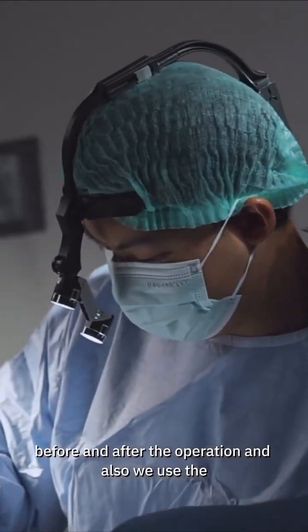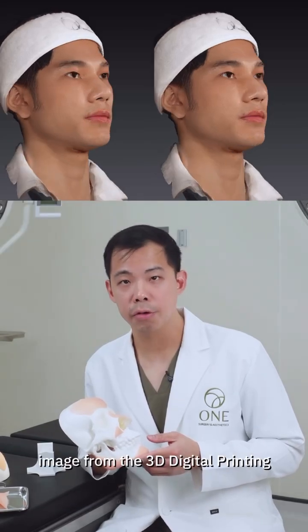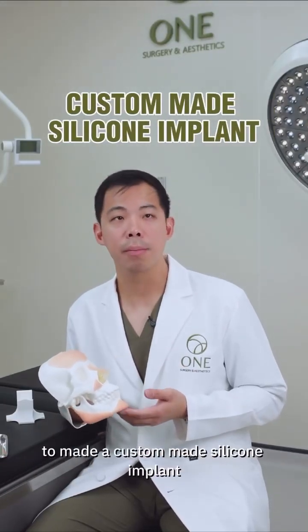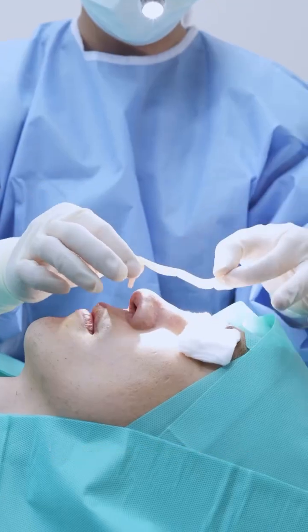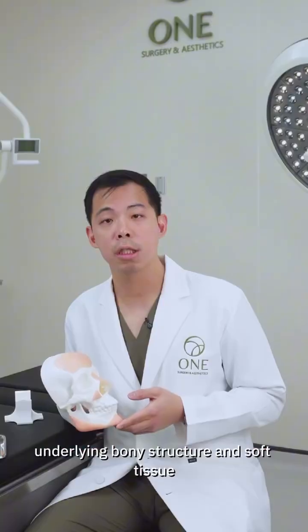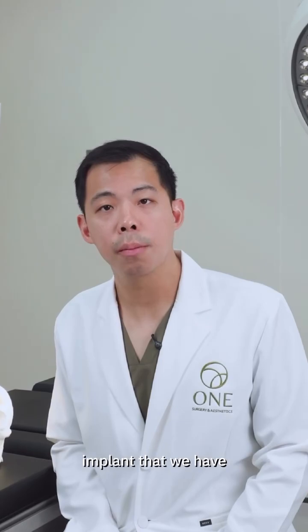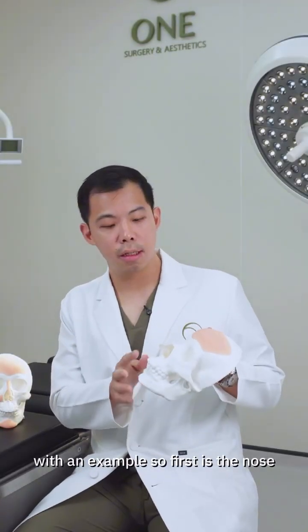And also we use the CT scan or the CAT scan together with the image from the 3D digital printing to make a custom-made silicone implant. Here as you can see, these custom-made silicone implants will have a perfect fit to the patient's underlying bony structure and soft tissue. So I'm going to walk you through all the silicone implants that we have with an example. So first is the nose.